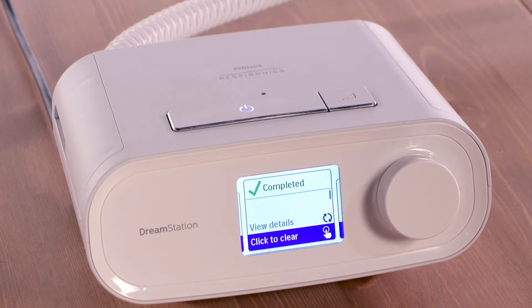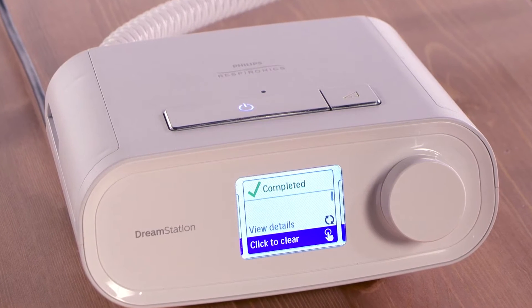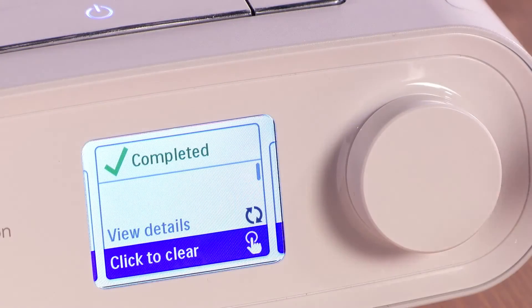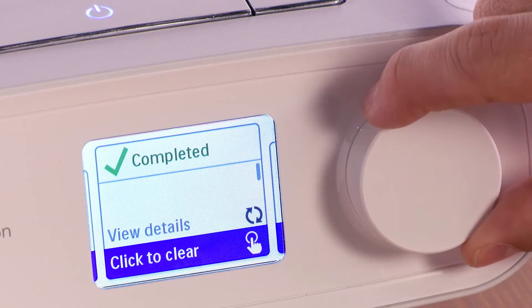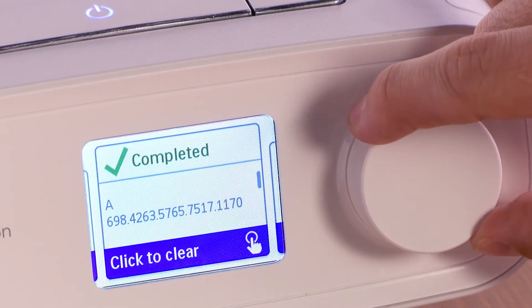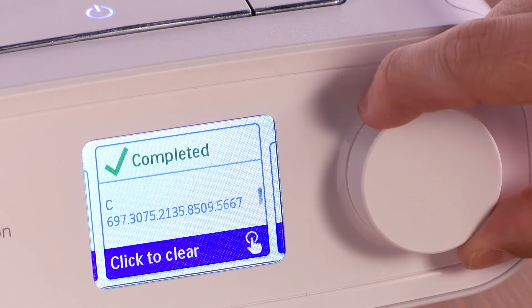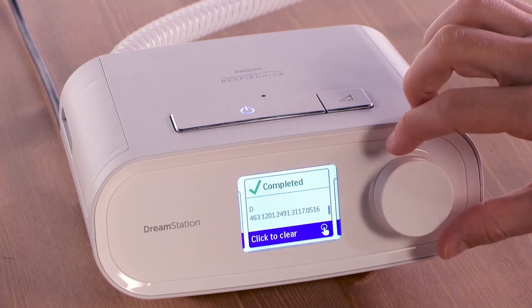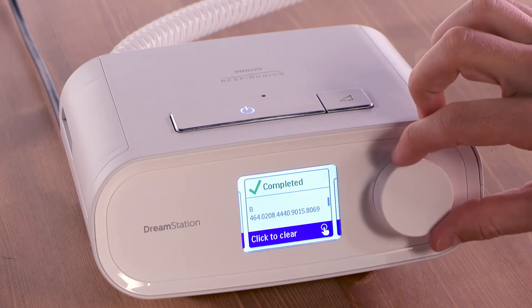After you complete a successful check, your provider may ask you to read Performance Check codes over the phone. Use the control dial to scroll down until the first Performance Check code is visible. The codes are titled Code A through Code E. Read each of the five 19-character check codes to your caregiver. They can decode these values to aid you in troubleshooting.